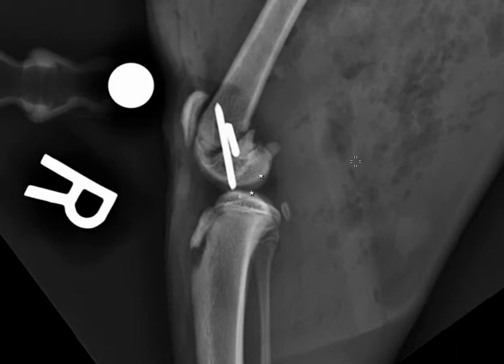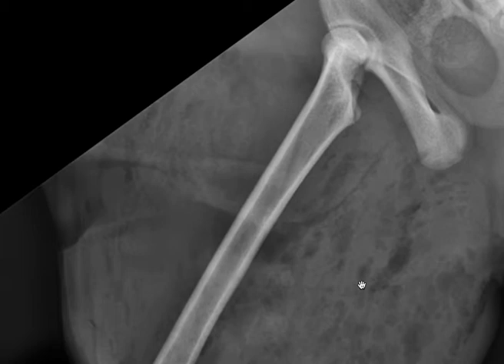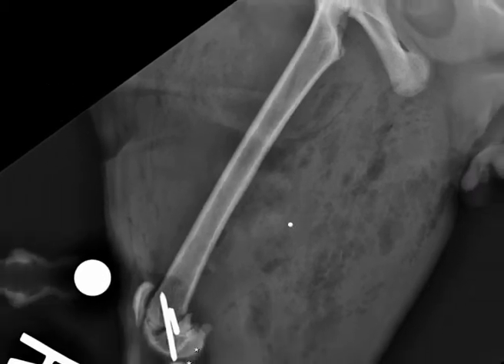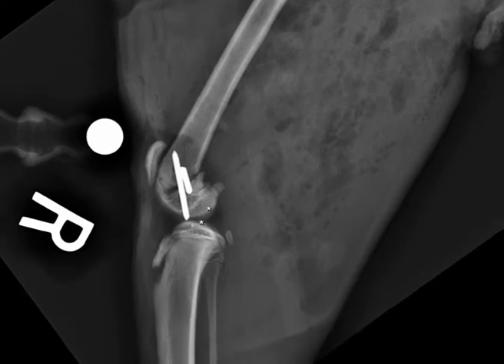Sometimes, after a fracture has been repaired, the surgical procedures can impact bone around it, so we make sure that there are no additional fractures seen. I moved up a little bit just to make sure that the hip was still appropriately placed. Occasionally, really substantial intraoperative manipulation can reveal other soft tissue or bone injuries that weren't evident on the preoperative study. As I look around, you may be noticing that the soft tissues, in addition to being really thick, contain gas. You'll recall that this was an open fracture, so this patient would need to be treated as if this entire area were infected.